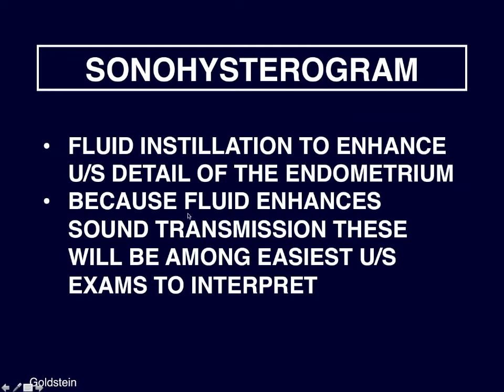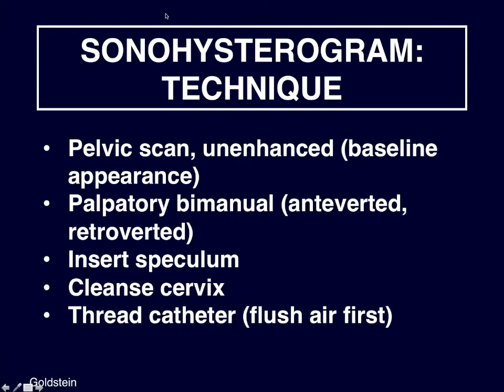We know that fluid enhances sound transmission, so these will be among the easiest ultrasound exams you will ever have to perform or interpret. I mean, the reason ultrasound is such a home run in obstetrics is the baby's in a bag of water. Fluid is your friend. It enhances sound transmission. The technique of sonohysterography is relatively simple.